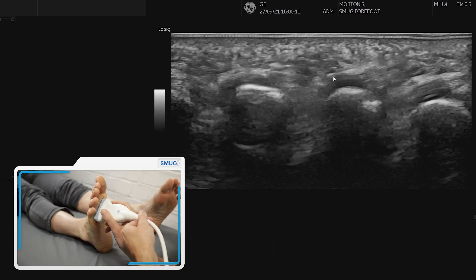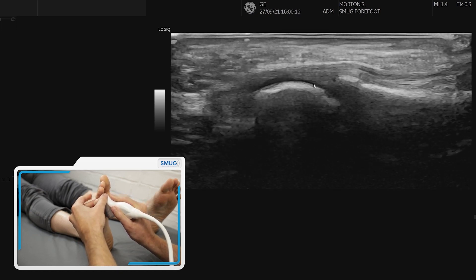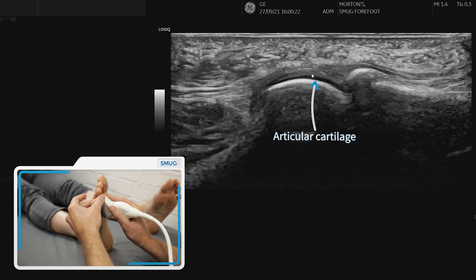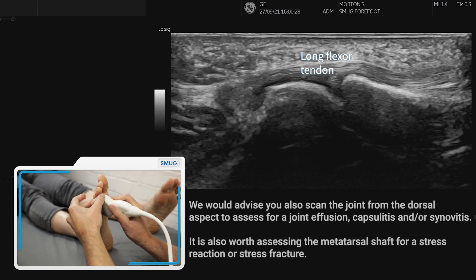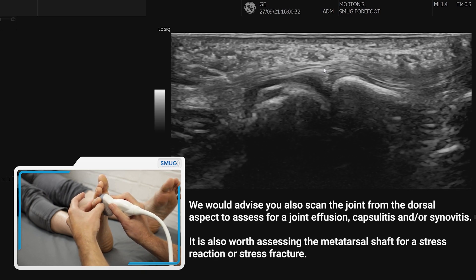We also need to look at this in long section. Going over the third metatarsal phalangeal joint we can see the plantar plate, the articular cartilage, and over the top we can see the tendon. It's important to assess the joint because that is one of the differentials when you've got forefoot pain.